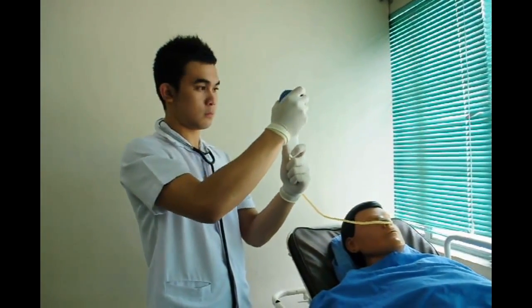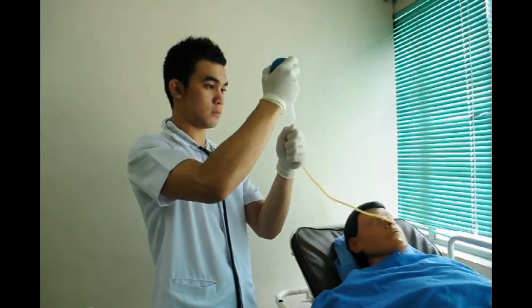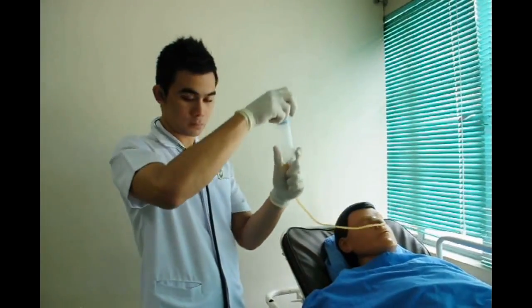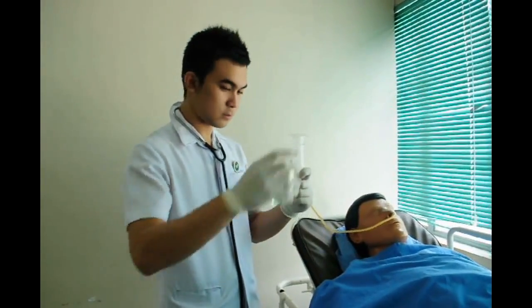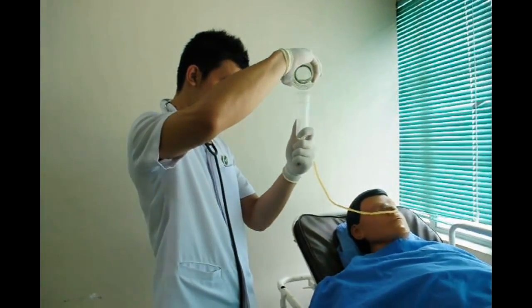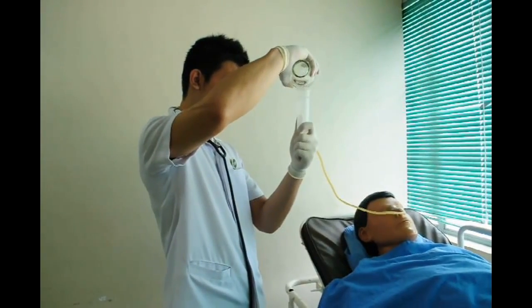Now, Nurse Kelvin is going to flush 30 ml of water and let it flow by gravity. This is to maintain a patent tube.